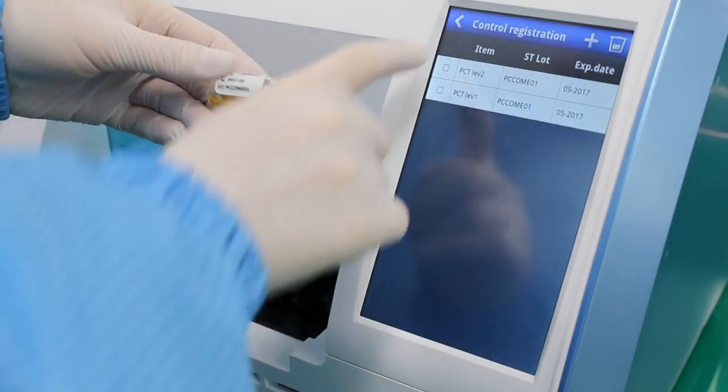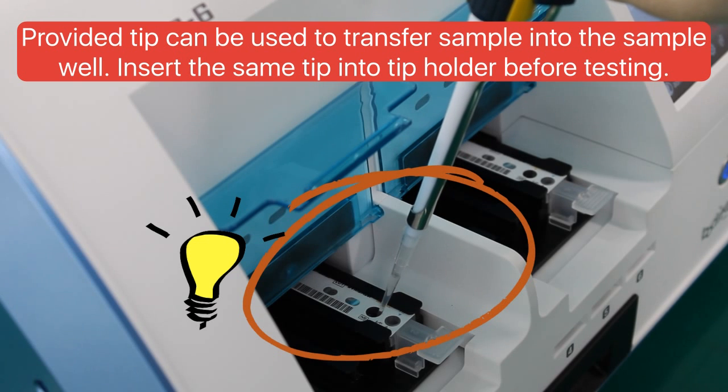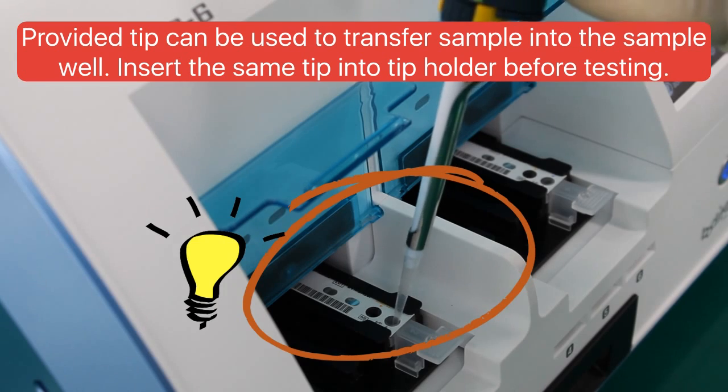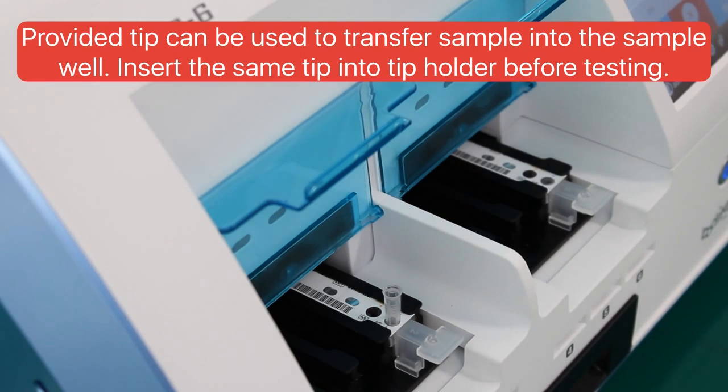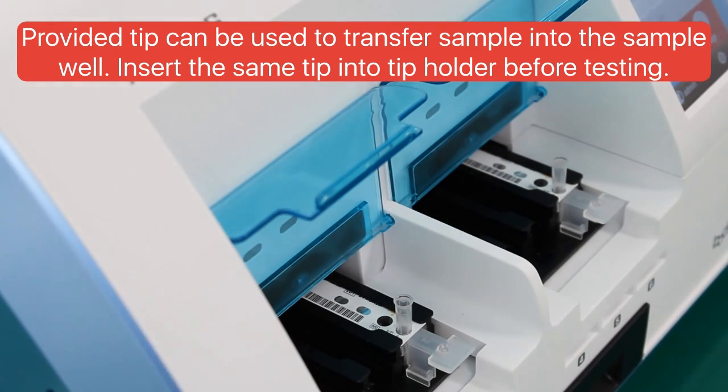After registering both controls, go back to the CalQC screen. Insert two cartridges of the same PCT lot number you want to check in channels 3 and 6 only. On screen, dispense level 1 control in channel 3 and level 2 control in channel 6.